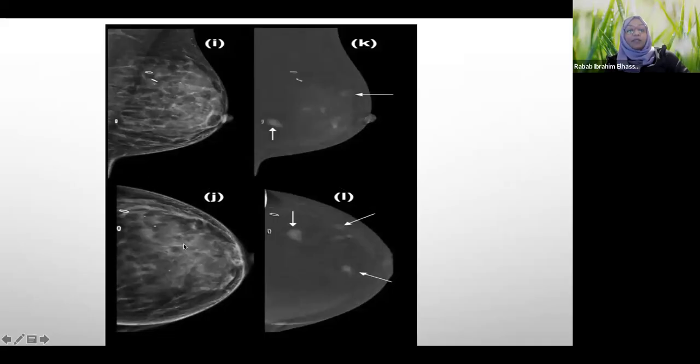Another example of multifocal disease, multicentric actually, detected only on contrast enhanced mammogram. You can see multiple areas of enhancement, which denotes multicentric disease, and this breast is not conservable. So it upgrades the surgery, in a matter of 10 minutes for this modality.